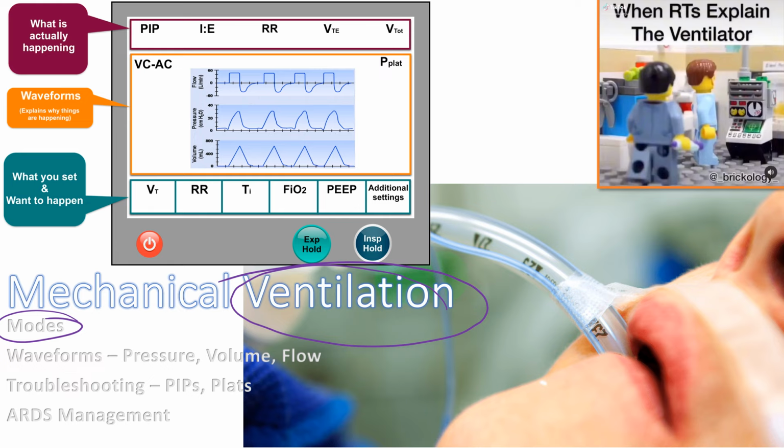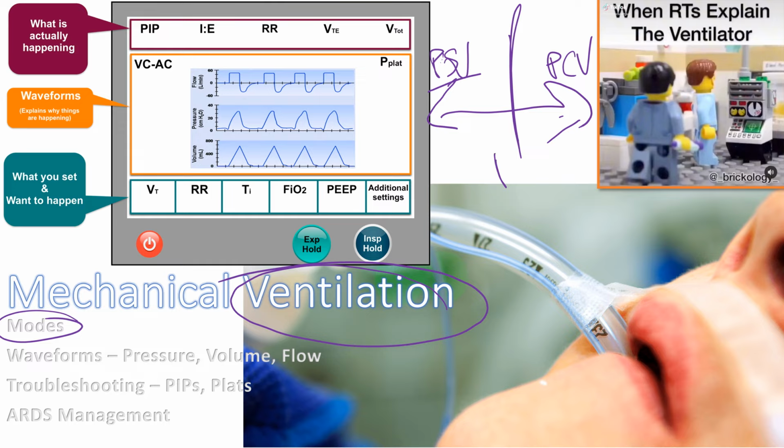And you want to know which ones are the worst modes, where someone's in a lot of trouble, pressure control ventilation, versus someone that's in an SBT mode where they're just weaning. That's actually called pressure support ventilation. I have to pause to make sure I get them correctly because I honestly confuse them all the time too. That's support, supporting them to get off the ventilator, whereas pressure control is where you're in control, doing all the work for them. And then we have the middle of the road one, which is your PRVC, which we'll talk about.